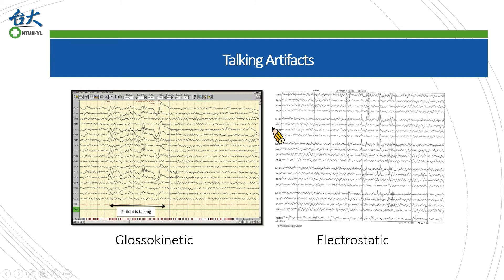Another type of talking artifact we call electrostatic artifact. It is actually a little bit strange to use this terminology because electrostatic often indicates the signal is interfered by environmental electrostatic fields, for example people walking by or nearby machines. In this example it is more like a surface EMG during talking.